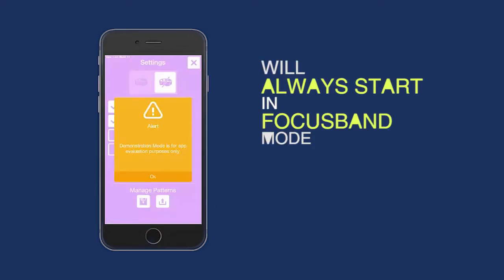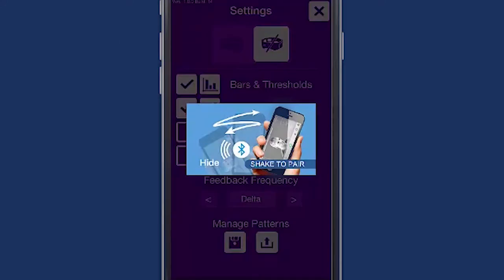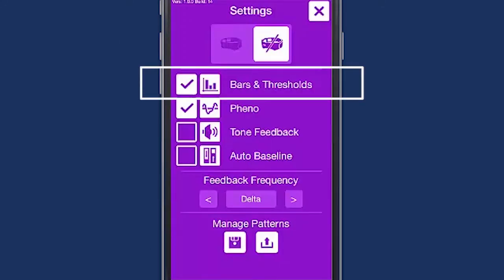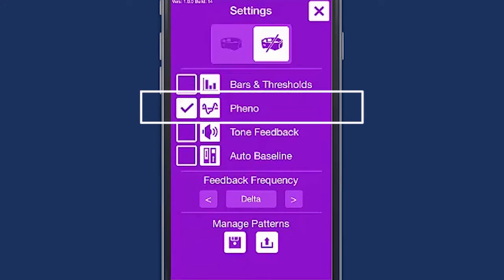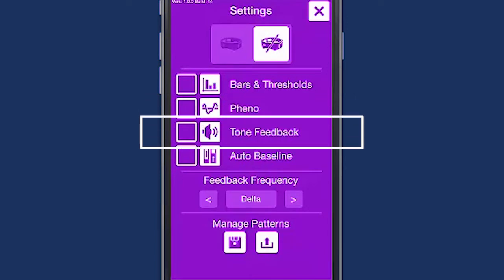Select either Focus Band or Demonstration mode. The app will always start in Focus Band mode. The bars and thresholds display the amplitude bars and thresholds on the display. Pheno displays the user's average threshold amplitudes.